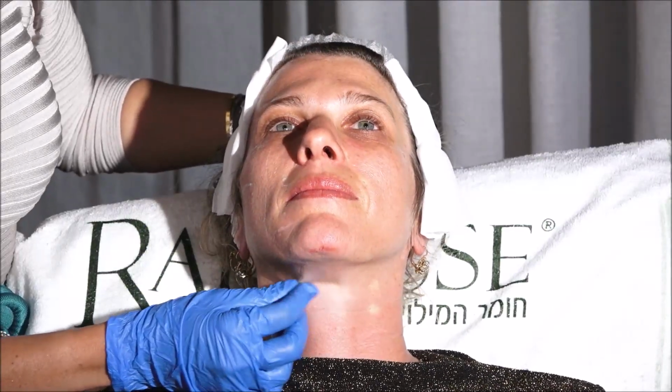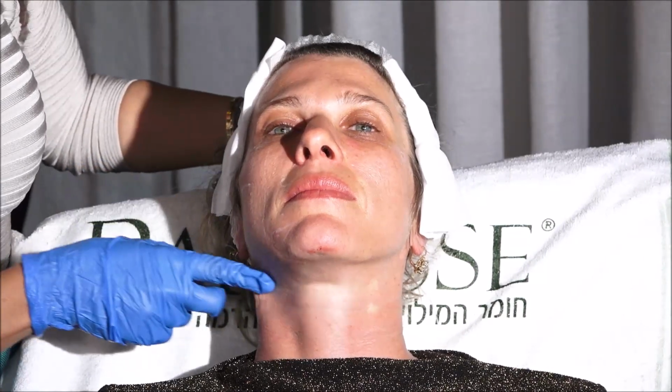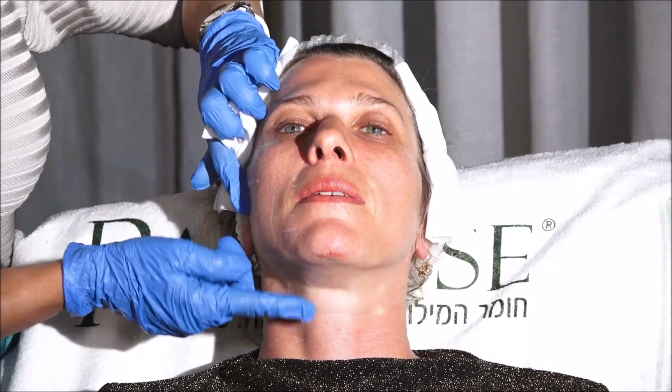Let's see about her. Much better. This side was even worse than the other one, the wrinkle. The rest we're going to correct just doing the skin here, not only in the neck, but also in the jawline. And the more we correct here, the more we correct there. So all the tightening in this direction will influence the neck.